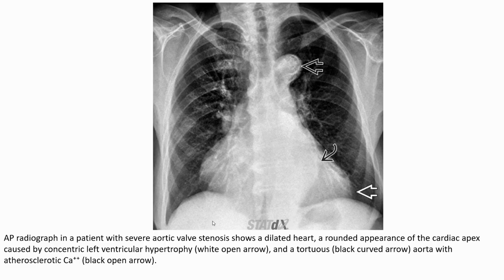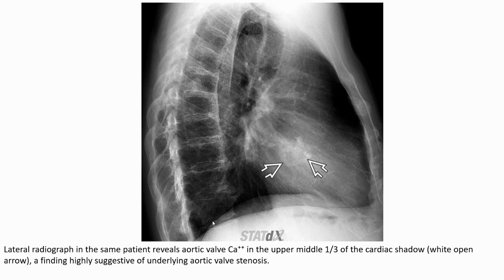This AP radiograph in a patient with severe aortic valve stenosis shows a dilated, half-rounded appearance of the cardiac silhouette caused by concentric left ventricular hypertrophy, and tortuous aorta with atherosclerotic calcification. On the lateral chest radiograph in the same patient, aortic valve calcification is revealed in the upper middle one-third of the cardiac shadow — a finding highly suggestive of underlying aortic valve stenosis.